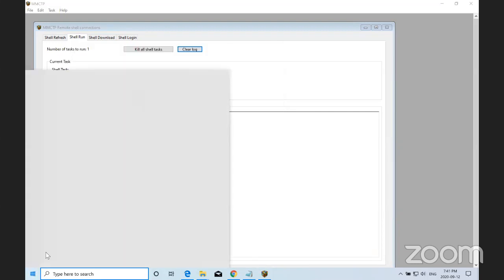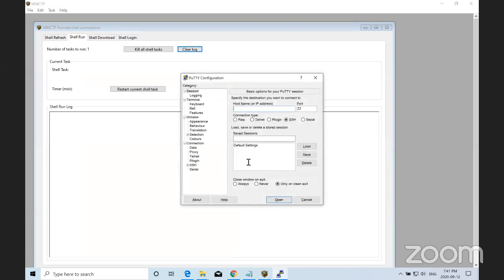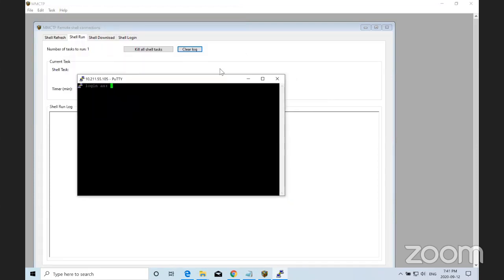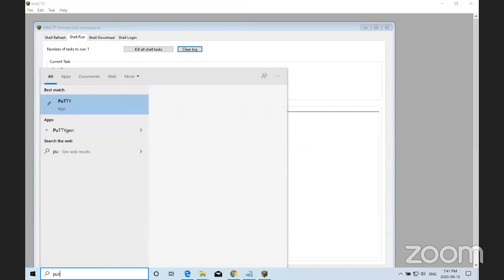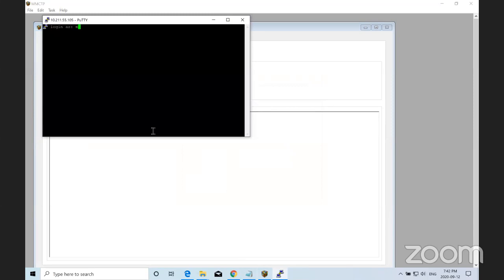Now, what I can do next, Wameed, is we could look into exactly what's going on there with the shell return. What it should do is hit yes to accept the key certificate. It may not be able to do that process with that current install for some reason. So we'd have to debug the return that's coming back. We can do that together later. Because it works on PuTTY. Yeah. I think it's SSH, if I'm not mistaken. Let's try it again. Okay, we'll try just one more time. But I think it works from PuTTY, it does not work from MMCTP. Yeah, that appears to be correct.